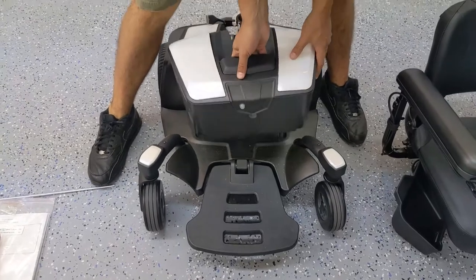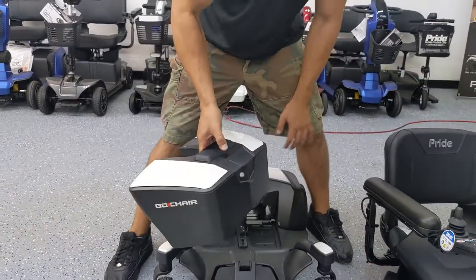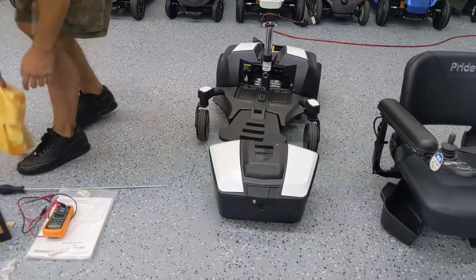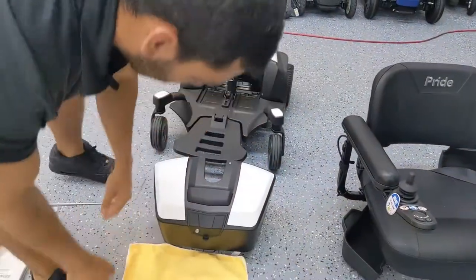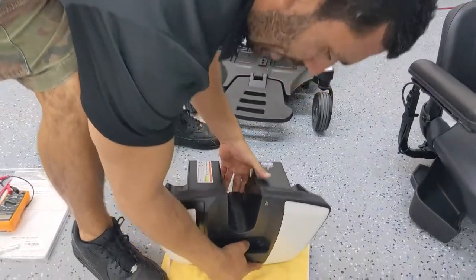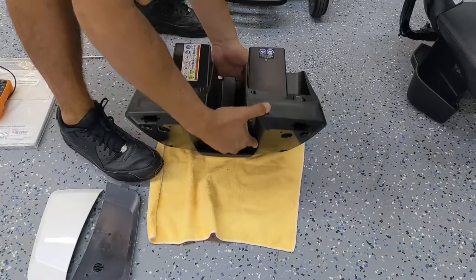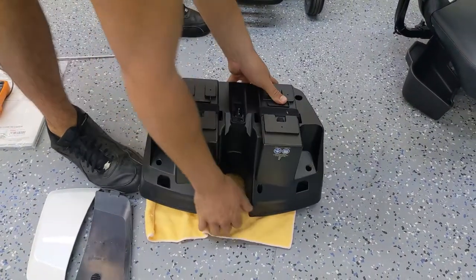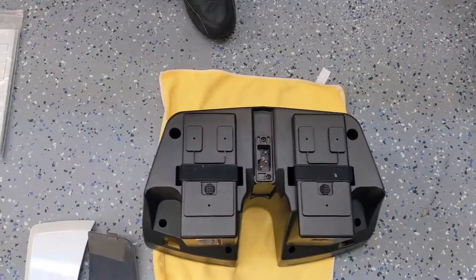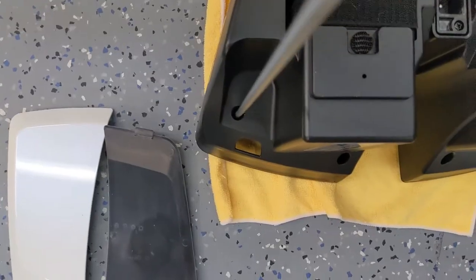This particular power wheelchair, like many others, has a removable battery pack, and in order to get the batteries out of the box, you're going to need that Phillips head screwdriver. I'm going to put a rag down, flip the battery box upside down, put those to the side, and you're going to see a couple of holes from the top which you'll need to use that long Phillips head screwdriver to remove the screws.